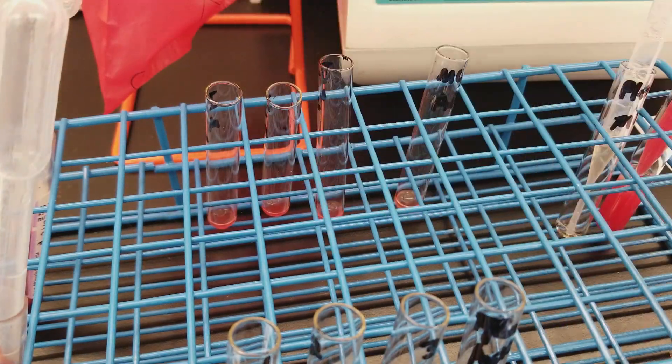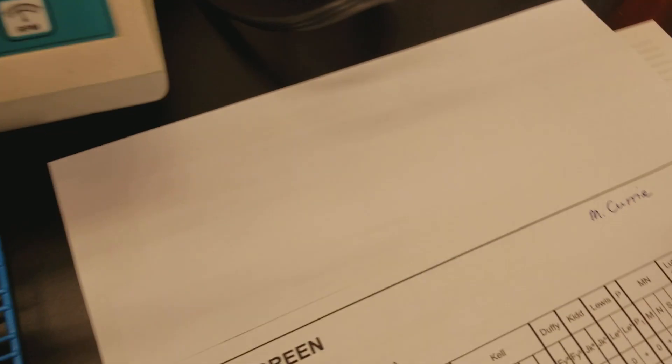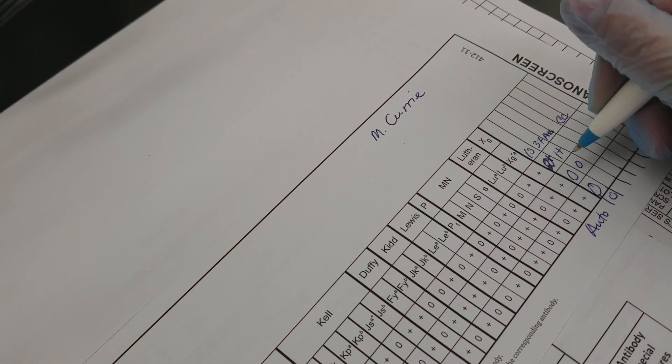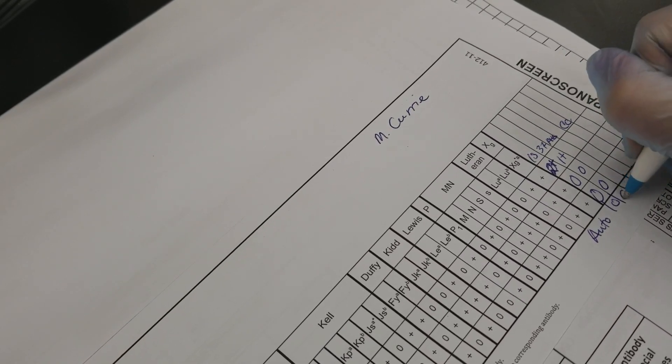So that was cell one for the patient that's positive, so I'm just going to put that it's a one plus. Auto control was negative. Now we'll do the supposed to be negative patient.